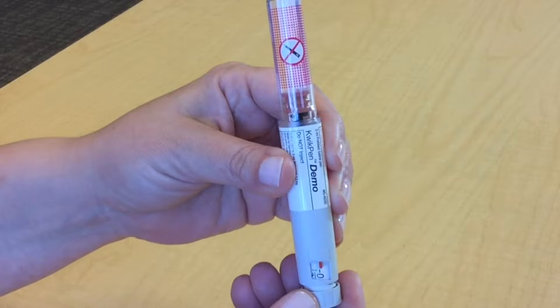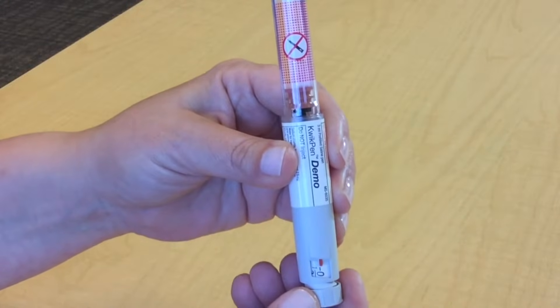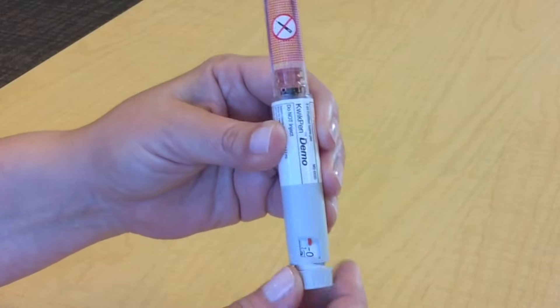Turn the dose knob until you see the correct number in the dosing window. It will be lined up with the dosing indicator, like this.